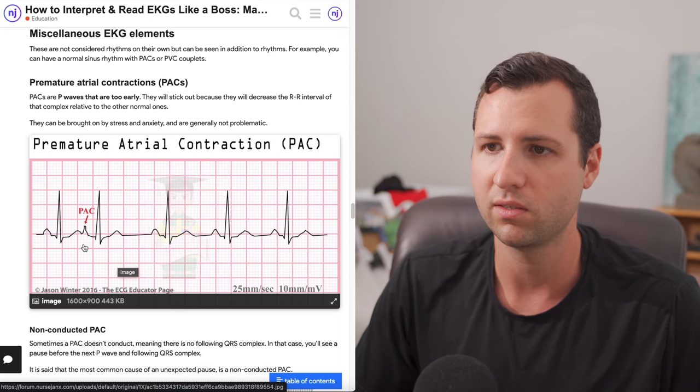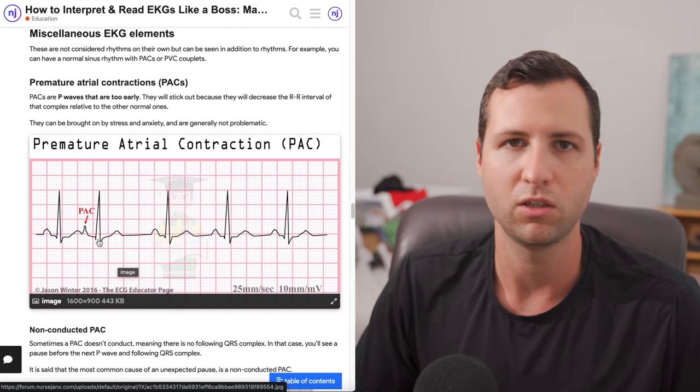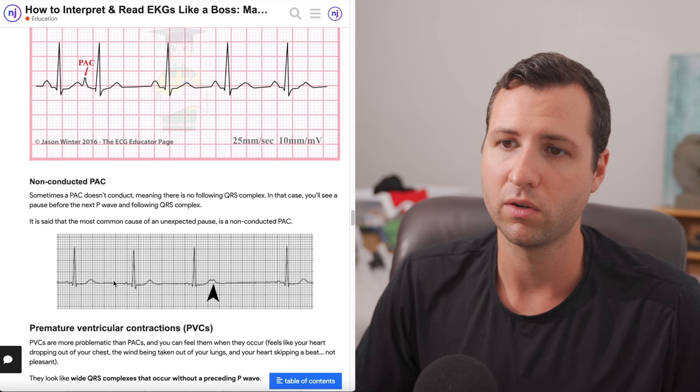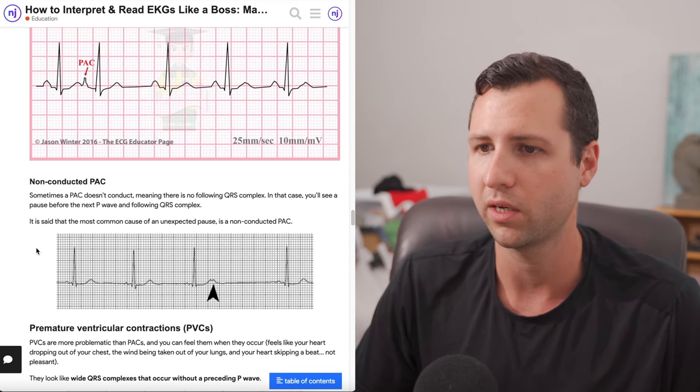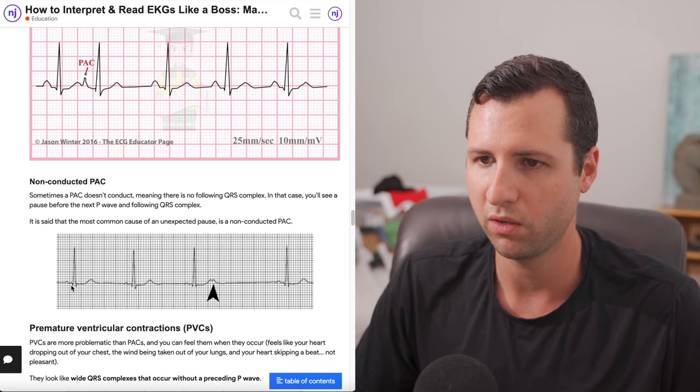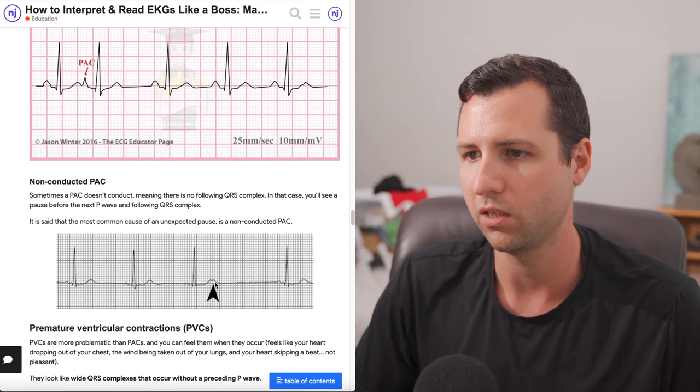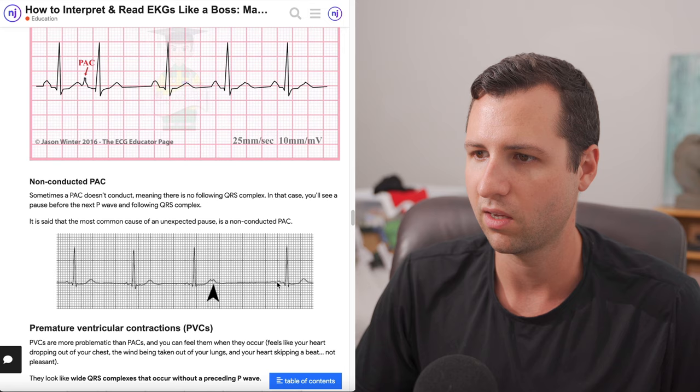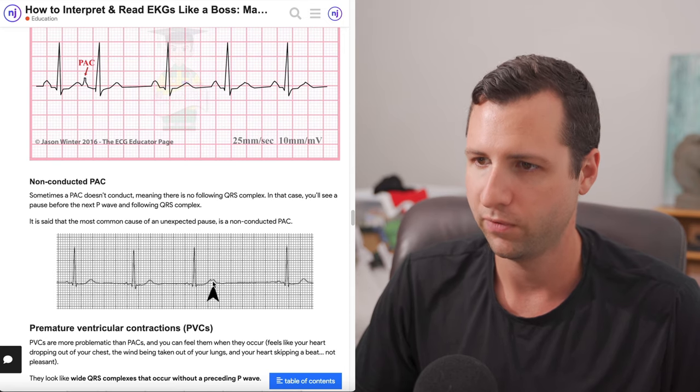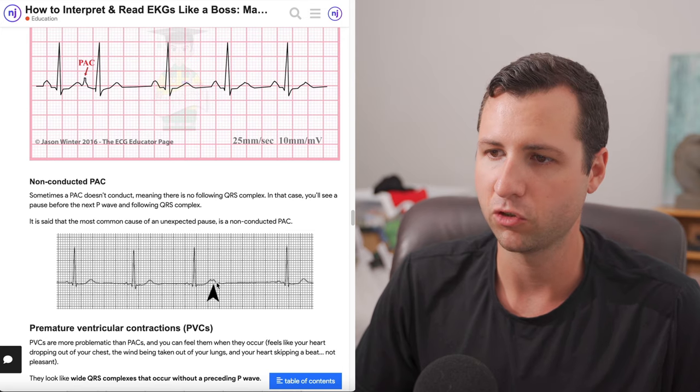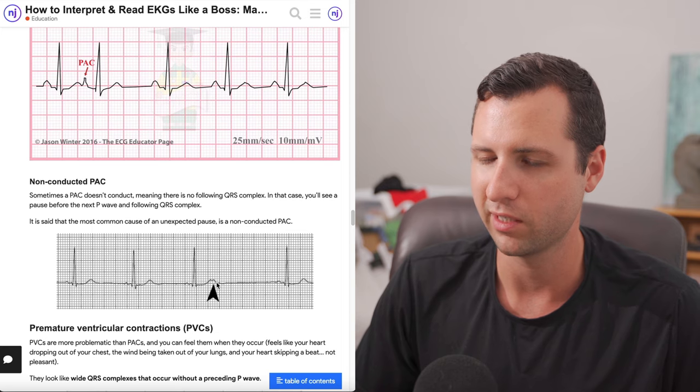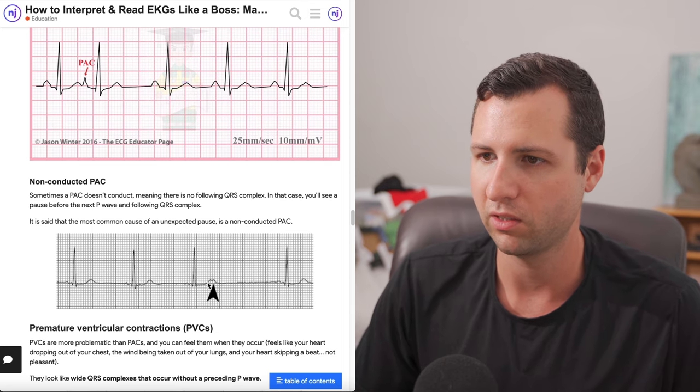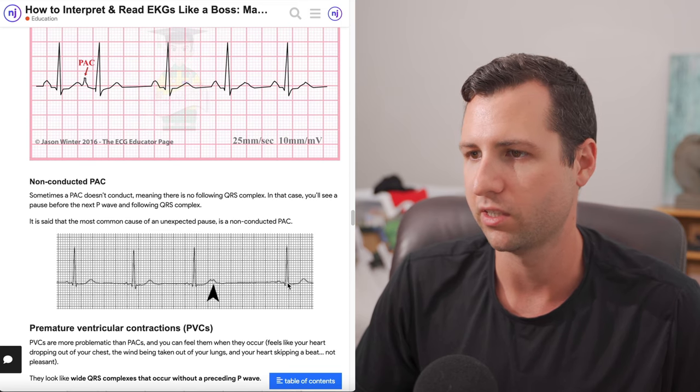This is going to be a conducted PAC because we have a PAC and then we have a QRS complex that follows it. There's also something called a non-conducted PAC, in which case we're going to have a PAC that will not be followed by a QRS complex. In this right here, we have P wave, QRS, T, and then nothing. Basically, it resets and all of a sudden it goes back into a normal complex again. There is this little wave - there's a T wave followed by the little P wave and then there's no QRS that follows it.